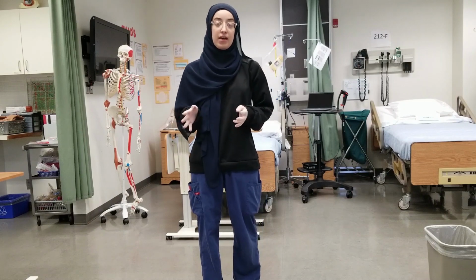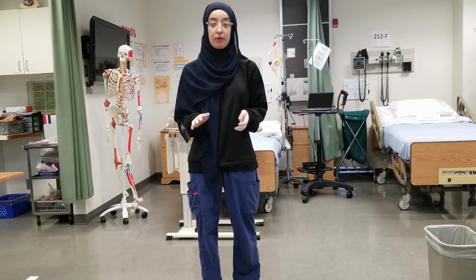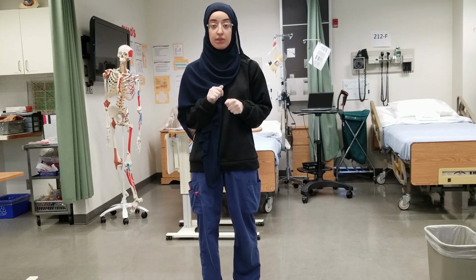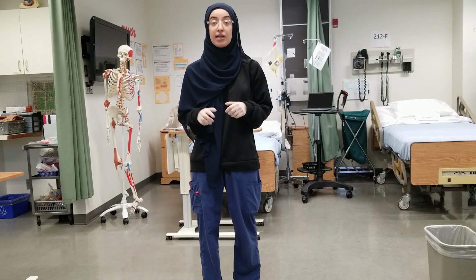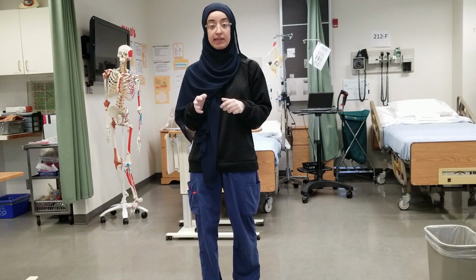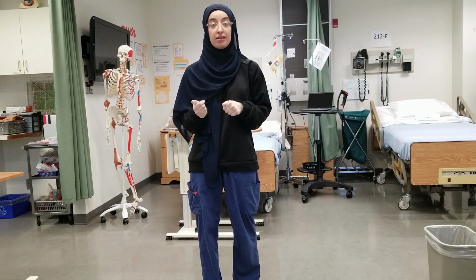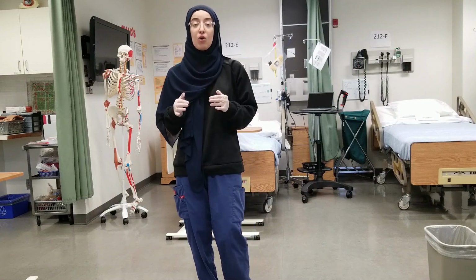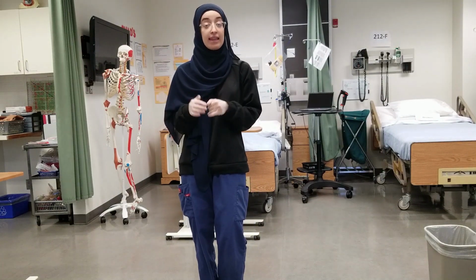So in the case of an adverse reaction, the first thing that we ever want to do is stop the infusion completely. Next thing that we want to do is discontinue the tubing, so we want to disconnect it from the patient, but you don't want to toss it. If there has been a reaction, we want to send the tubing, we want to send any extra blood that there is back to the blood bank so that they can analyze that blood to see if there was an issue with the blood itself or if it was an issue between the patient and the blood.